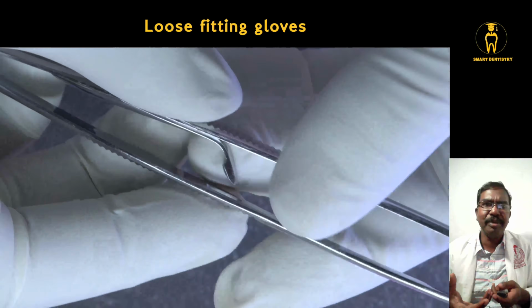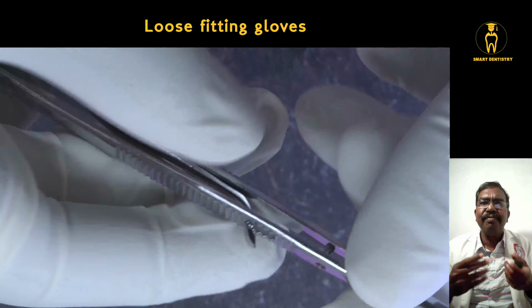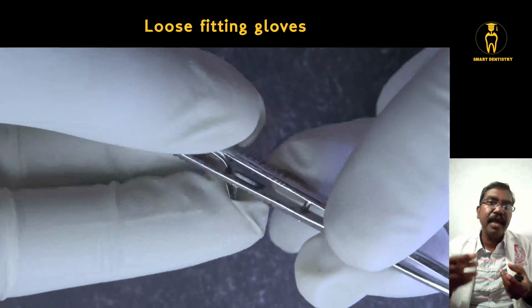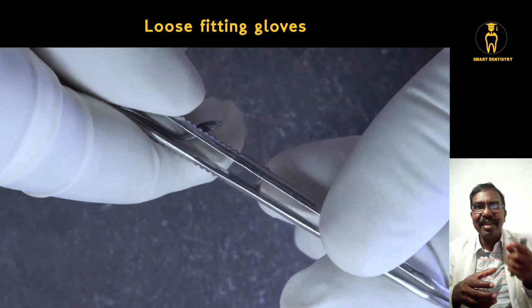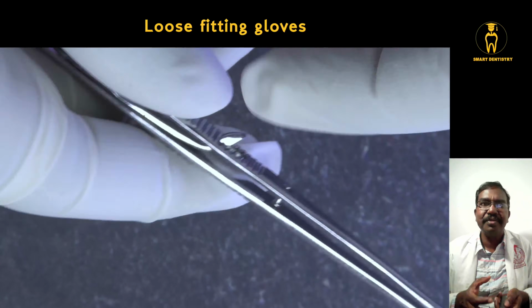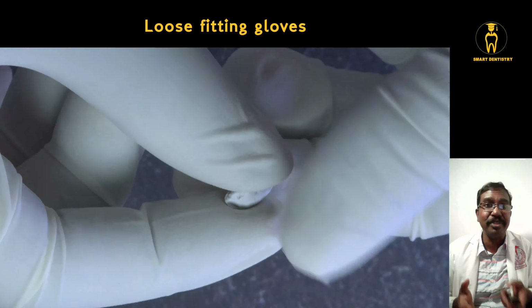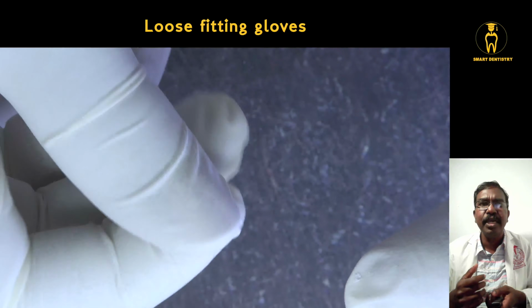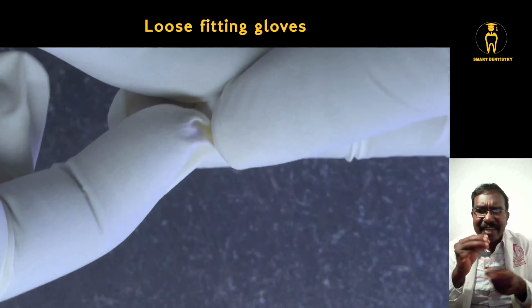And the second problem is, if you are using a locking tweezer, once in a while, whenever you are locking a GP and you are trying to place it, this loose glove will also get locked in the lock of the locking tweezer. Then it takes time to unlock it and remove it and pull it out, and everything. It is an episode. The next is, I always recommend kneading the temporary filling material before placing it. Once you are doing that, again the temporary filling material will also get entangled within the gloves.